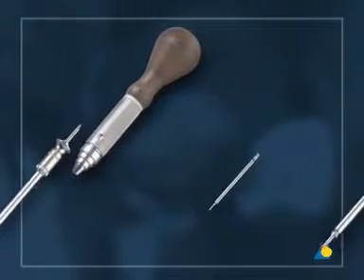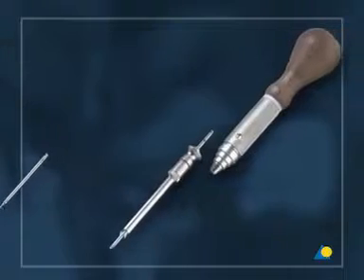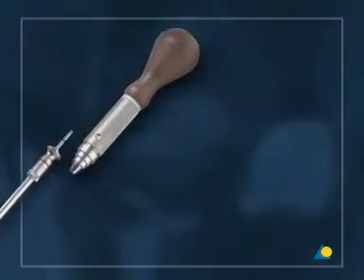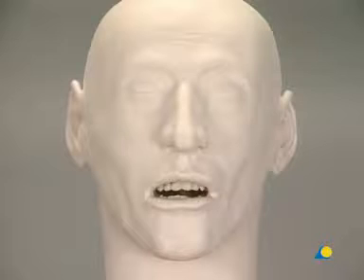For 1.5 mm screws: the 1.1 mm drill bit with 6 mm stop and the 1.5 screwdriver shaft with holding sleeve and handle. Gloves are recommended in this exercise to reduce the risk of allergic reactions.